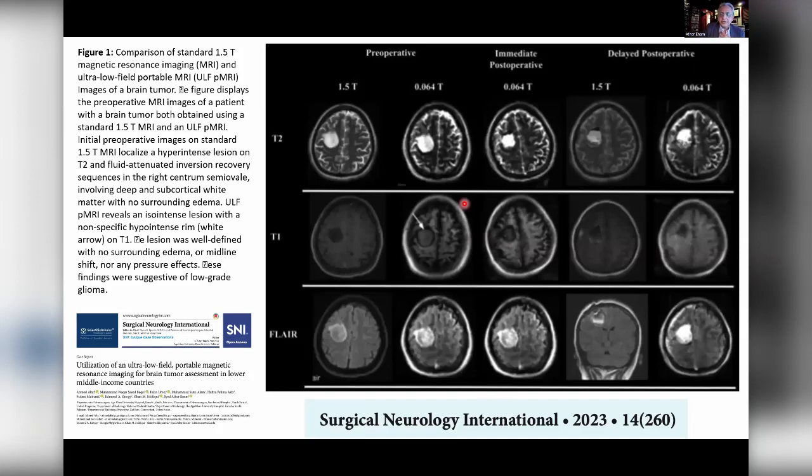From the perspective of a person working in a low resource setting in an LMIC, I would love to have a 3 Tesla MRI, but I don't need a 3 Tesla MRI. I need to just find out what's happening inside the head. Where is the tumor? Is it herniating? Is there bleeding? And things like that, so I can make my next decision. If you look at this MRI, 1.5 Tesla versus this ultra low field MRI, it tells me exactly where it is and what's going on. There are slight differences in the images in T1, but as we get used to these images, we should be able to understand very well what's going on.